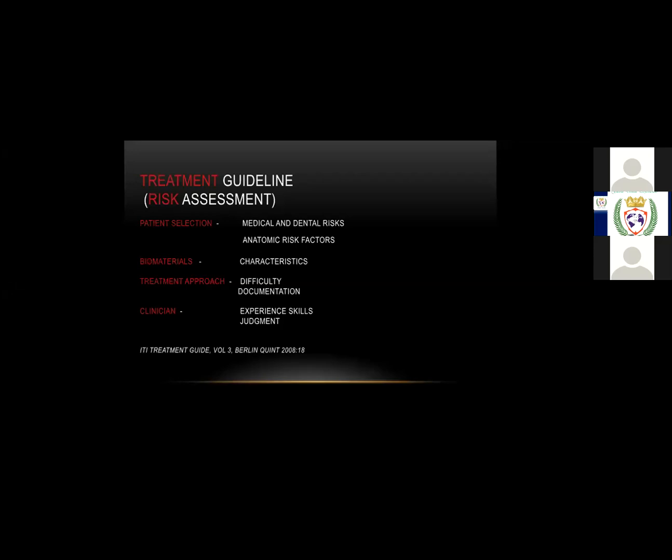So biomaterials, definitely you have to look into a better product. So the implant manufacturing whole technology has changed. Earlier we used to get the machined implants, the surface treatments were different. Now we get better surfaces, so better surface treatment. So look into what type of surfaces your implant you're going to use has, and see the literature and see the success rate of it, and see the whole company.